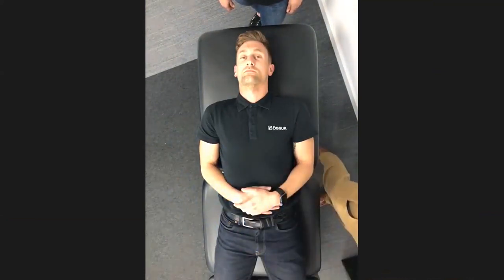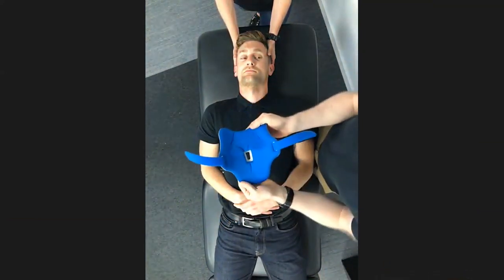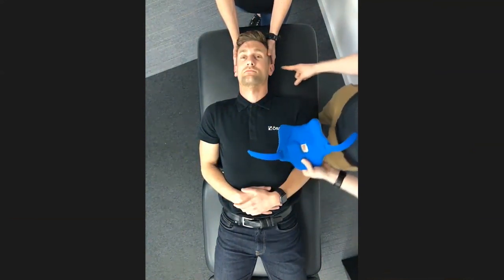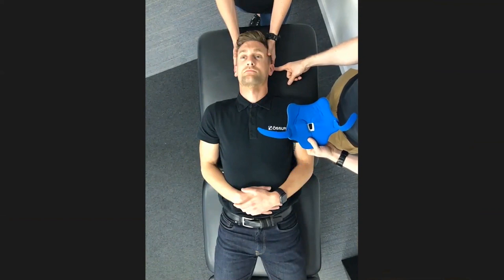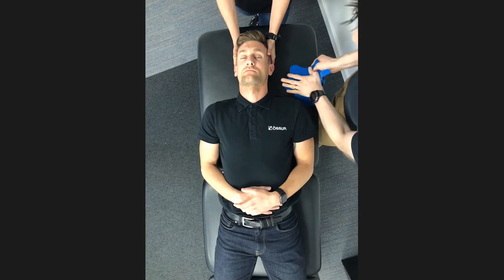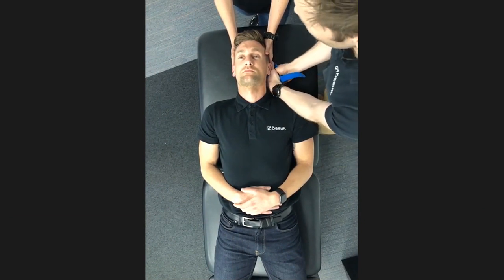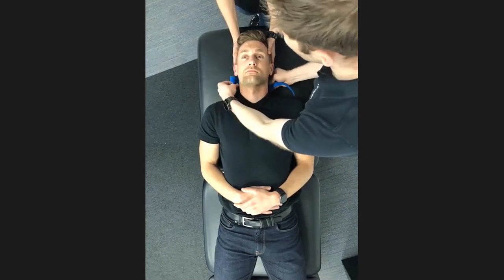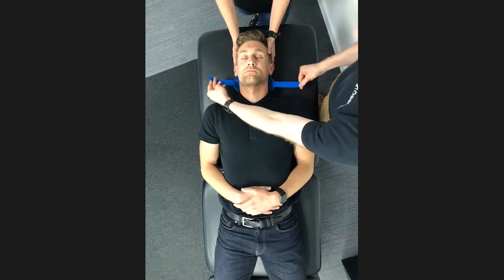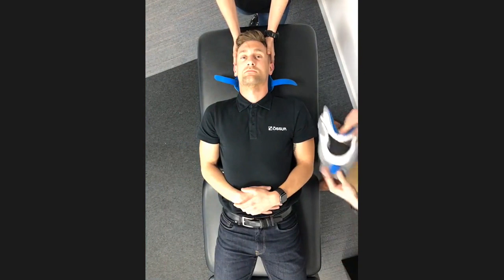Okay, so Maxine's just going to support the head here like that, and we're just going to slide the back section of the collar into position. So it's important to think anatomically: we want the top of the collar to cradle the tip of the occiput. So we've got someone supporting the head, we're pushing down into the supporting surface and sliding the collar through into position, making sure that we've got an even amount of collar either side. So it's nice and parallel, and we've got an even amount of positioning either side.